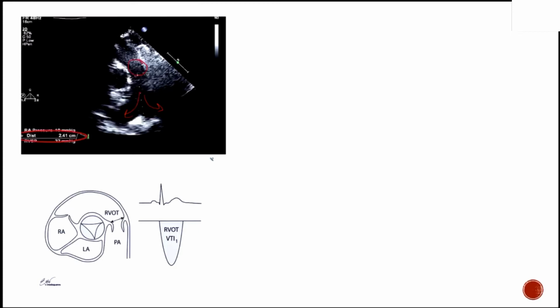Now, let me ask you a question. Let's say our left ventricular cardiac output is equal to our right ventricular cardiac output. We don't have these problems present. Would the VTIs be the same? Can the VTIs be different in these two? They can be different. And why can they be different? Right. If your outflow diameter is different and you have the same cardiac output, then your flow must be different as well. And this is going to be a good transition over to Bernoulli's equation.